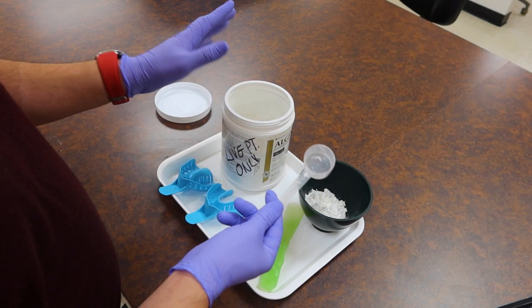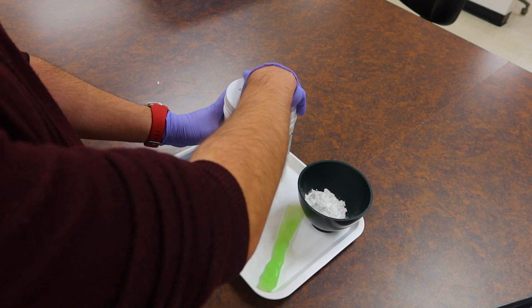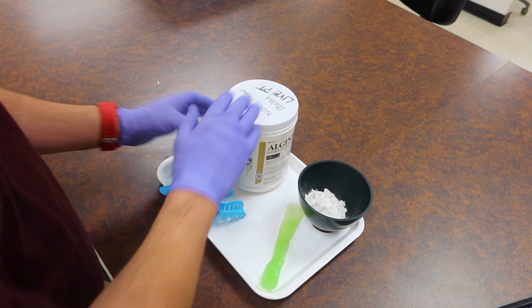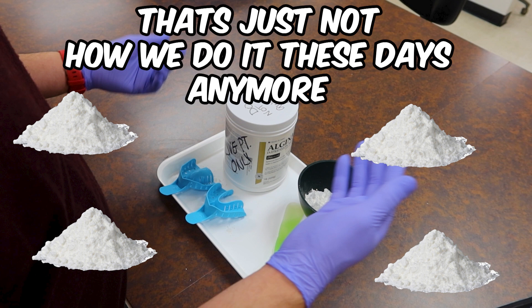Since we're done setting up for this impression, put your scoop back into your bin, close the lid, and make sure it doesn't fall over making a mess in the dental office — that's not how we do it anymore. Also be sure you're wearing your PPE. Protect those eyeballs and lungs so that when this stuff gets airborne it doesn't cause any damage to your body.